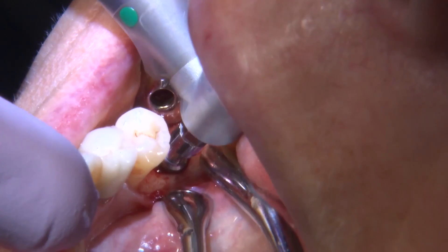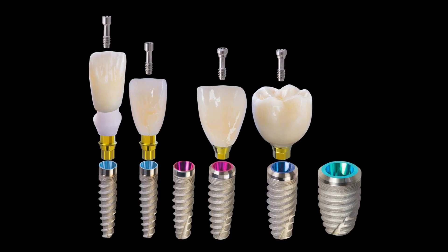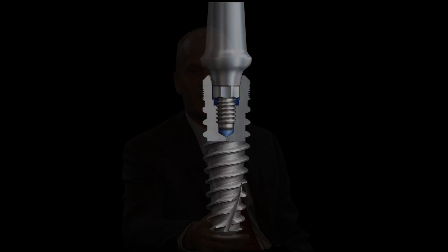Having that initial stability allows me to place a temporary cylinder and start molding the tissue from the very get-go by placing a temporary restoration. It comes all the way from a 3mm diameter up to a 7mm diameter. I love the 3mm diameter implant for laterals because I can ask Glidewell to fabricate a custom abutment out of zirconia to a titanium base for aesthetic results in thin areas like that. And it goes all the way up to 7mm, so an immediate implant for a molar that I've just removed on a lower arch becomes much more predictable. With the Hahn implant system, they get a full array of implant sizes. Because of the pricing with the Hahn implant, it's very, very economical for the doctor to have a full inventory in their office.